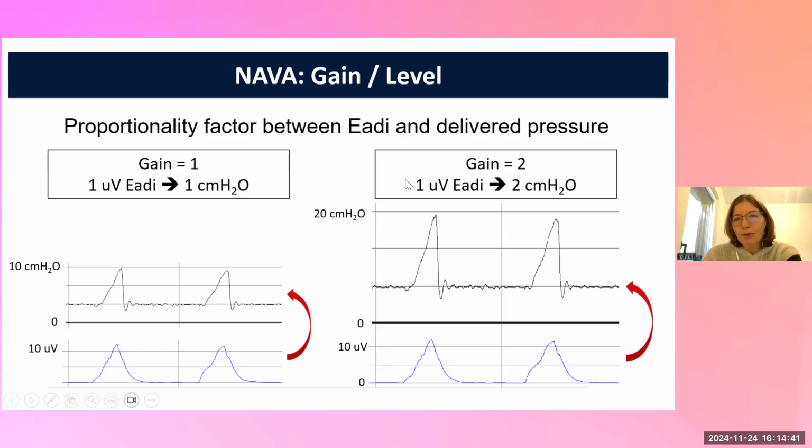If you now put the gain at 2, you see that for the same maximal value of 10 microvolts of EADI, you are going to deliver 20 centimeters of water. And this is the gain.